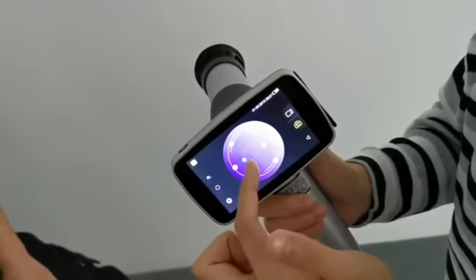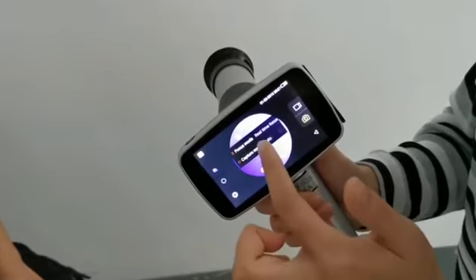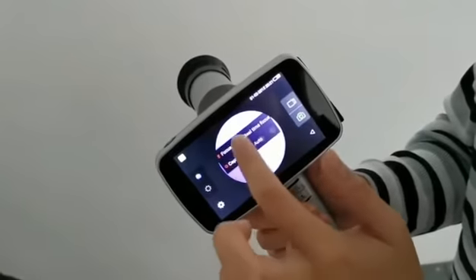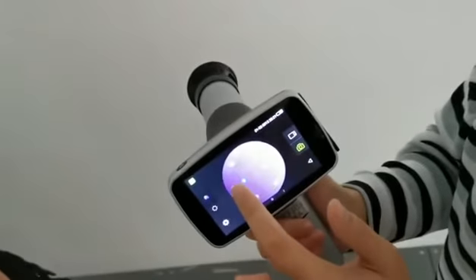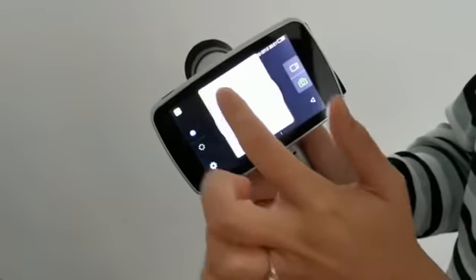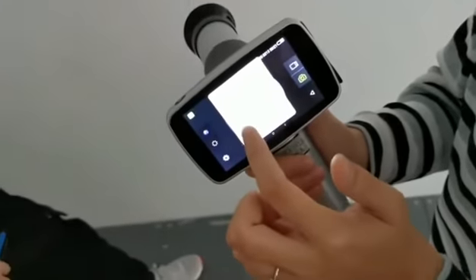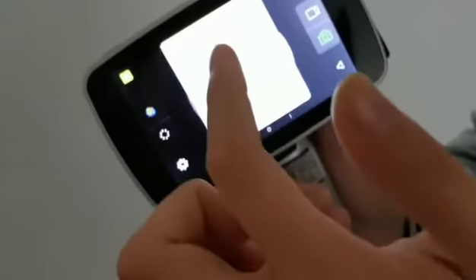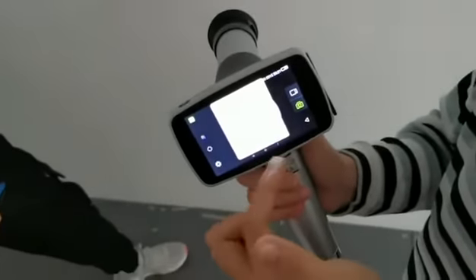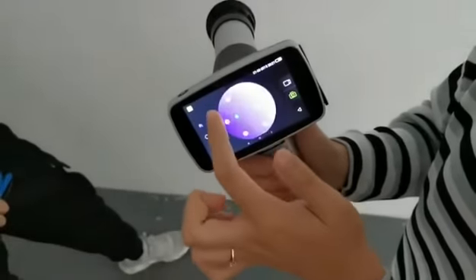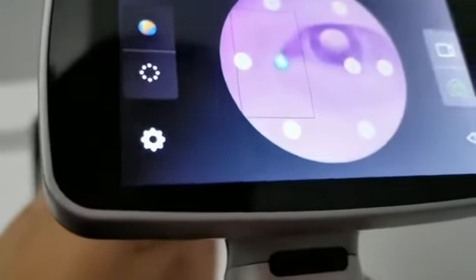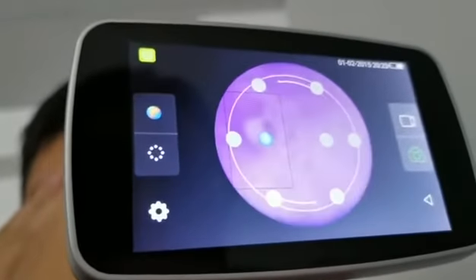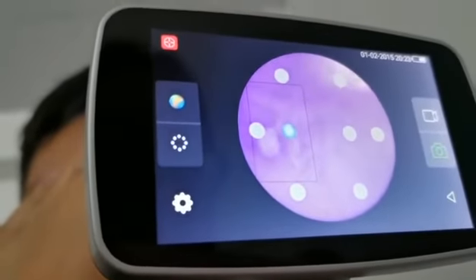For focus mode, there are two modes: real time and manual. Normally we choose real time. For the capture mode, auto will cover about 90% of all situations, but sometimes if in auto mode the image is too dark, you can change to the manual mode using the circle up here.